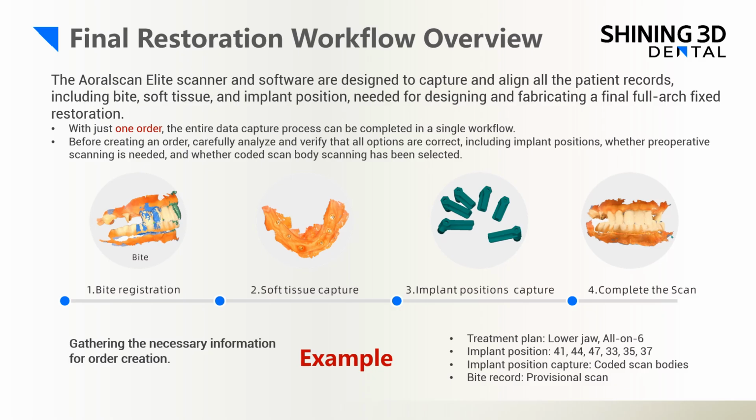fixed restoration. With just one order, the entire data capture process can be completed in a single workflow in Aoralscan Elite. Before creating an order, carefully analyze and verify that all options are correct, including implant positions, whether preoperative scanning is needed or not, and whether coded scan body scanning has been selected or not.